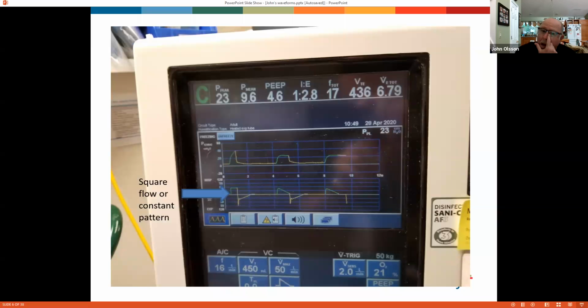So here's an 8400. It's a Puritan Bennett model. These are actually a 20-year-old platform. We use a lot of these. There are a lot available out there, especially after COVID, people are just buying them up, and they're not very expensive ventilators, whereas some of the newer ventilators are a lot more expensive.